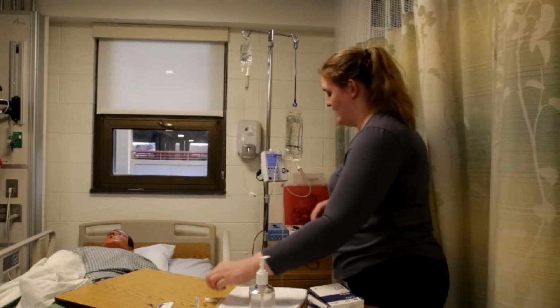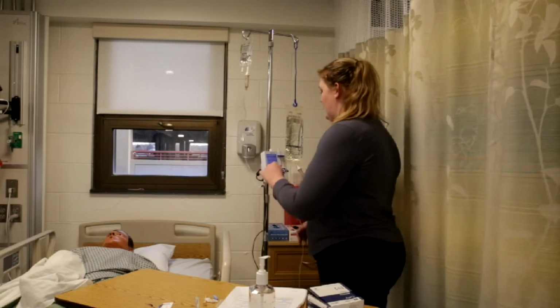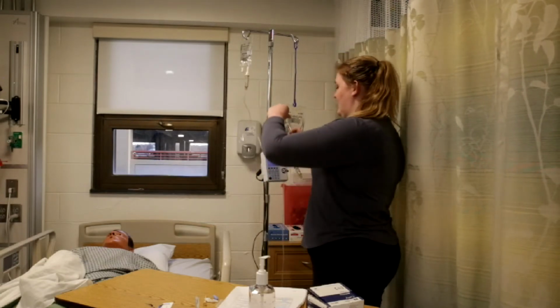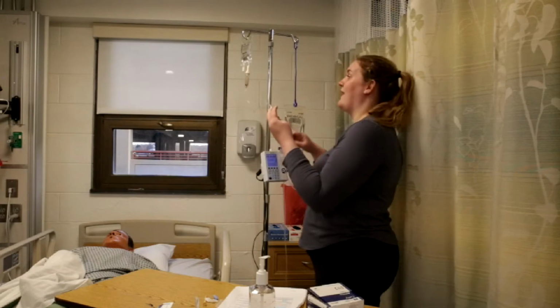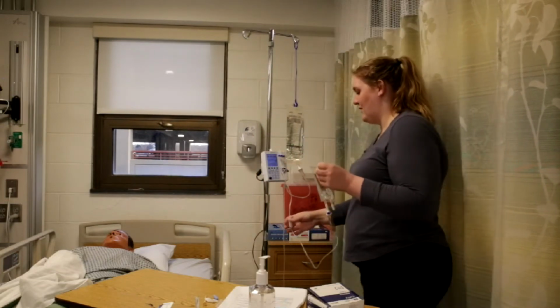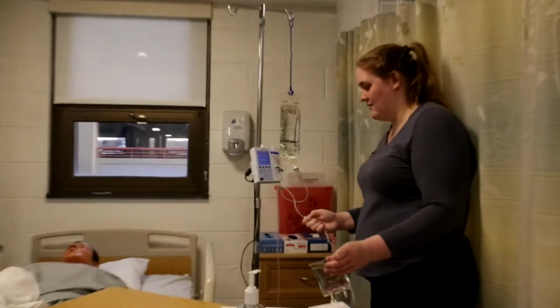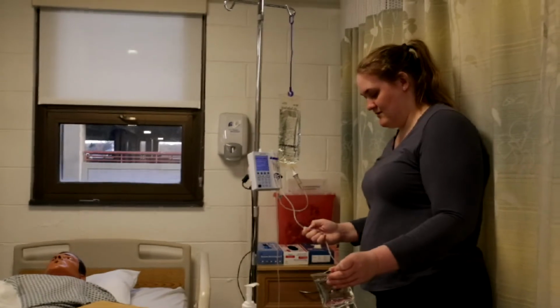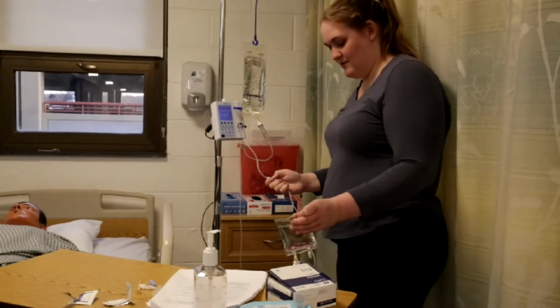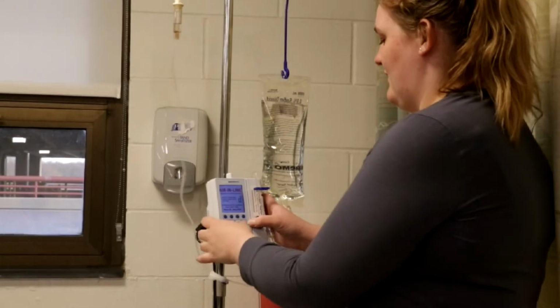Okay. And then making sure that this is unclamped. Now we're going to prime this by using gravity. So I'm going to take this off now and put it lower than that one. And then I'm going to unclamp it and let the fluids run in. And then clamp it. And I'm going to put it up here.